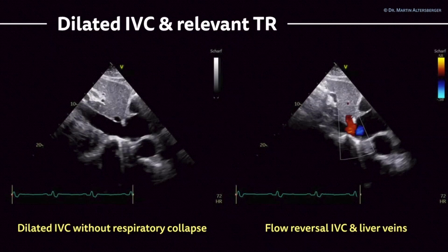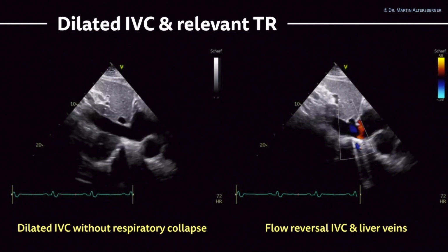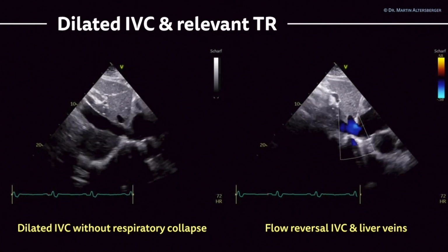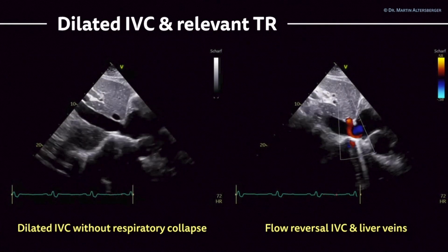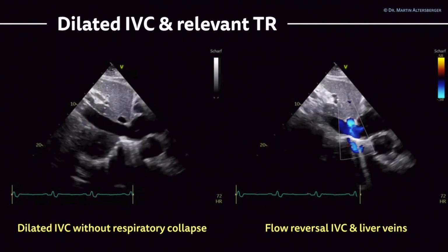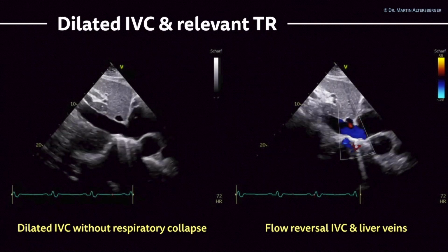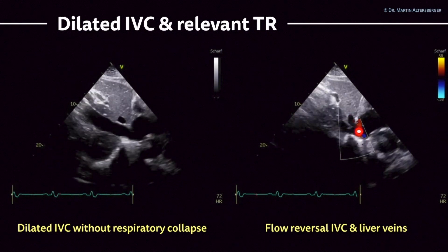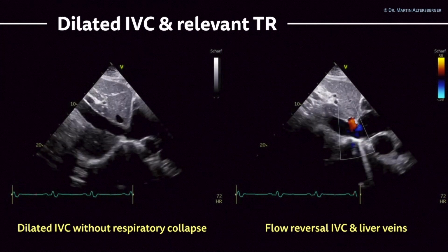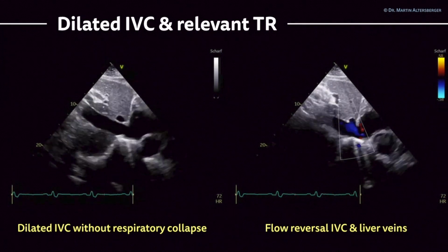The Eustachian valve you see over here, sometimes it can be really prominent and really large, but it always originates at the IVC. In this case, we have a dilated inferior vena cava and there is practically no collapsibility during respiration. So this is not an intubated patient. This shows hypervolemia. Also, if you take a look over here, there is pleural effusion present, and using color Doppler, you do see this change in red and blue color, even though there is a normal PRF optimized for echocardiography.